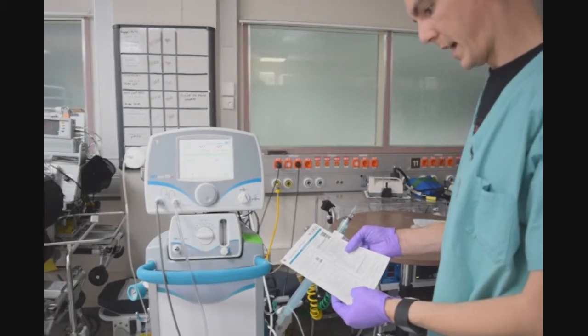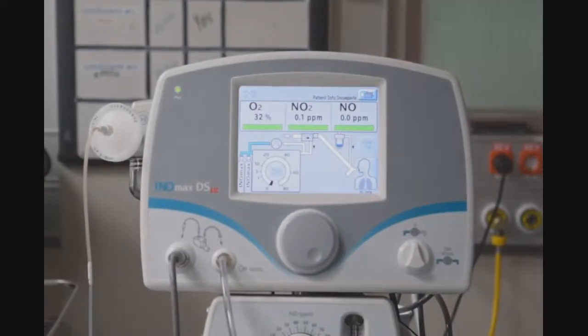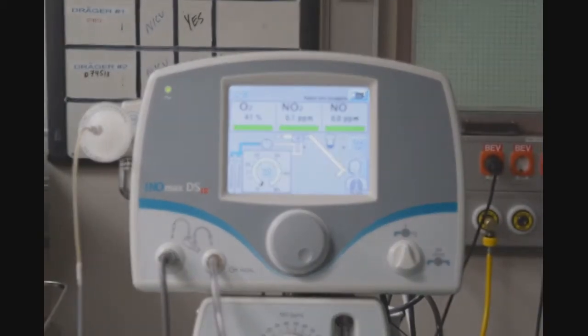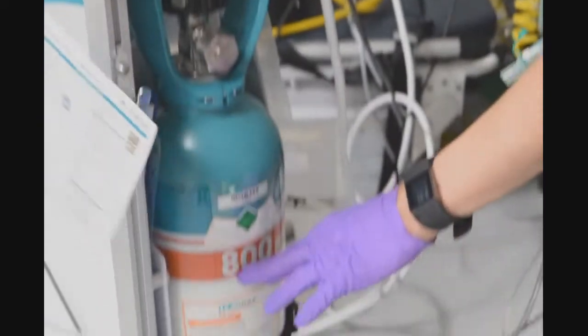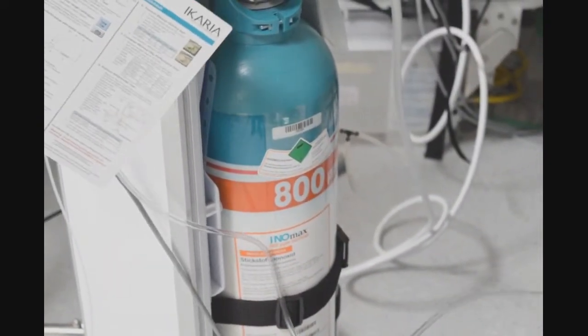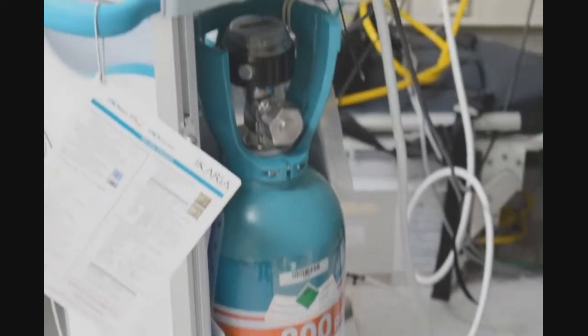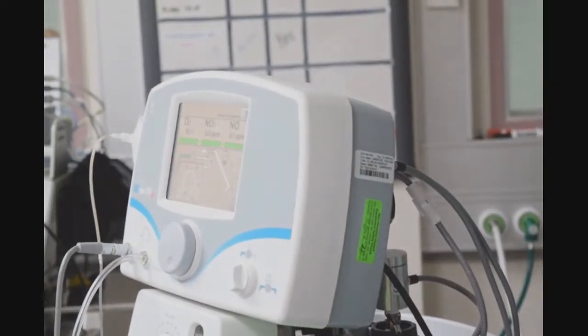Next, I will set the INLMAX dose to 40 parts per million for an 800 parts per million cylinder. I verify that I have 800 parts per million by looking at the side of the cylinder — in big, bold letters, it's labeled 800 parts per million. If there were any other dose, it would be labeled the same way; the other common dose is 400 parts per million.